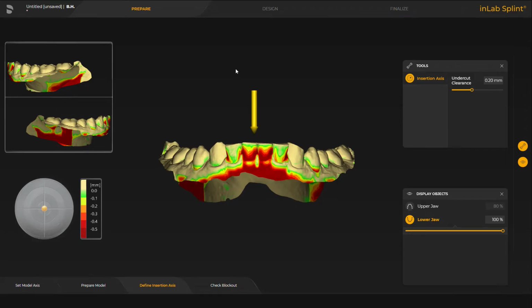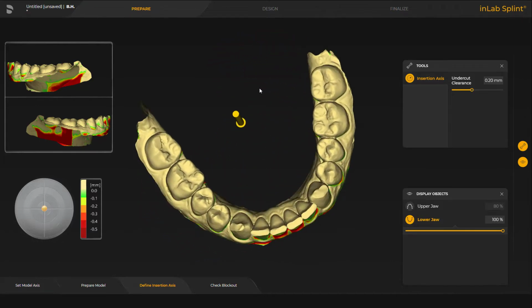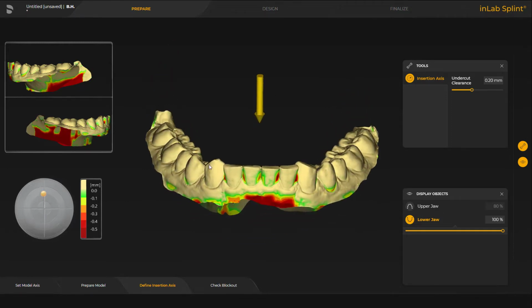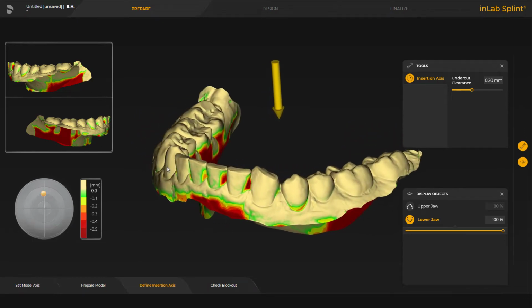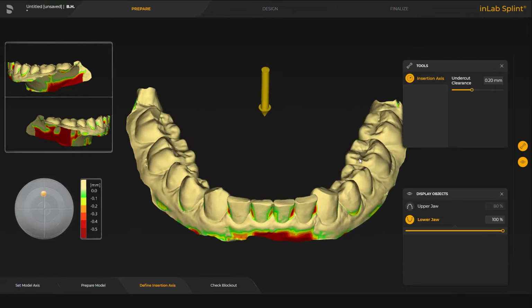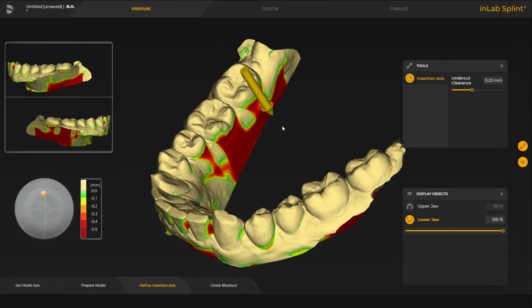The app will directly start with the insertion axis of our splint. So I'm going to try to find a nice insertion axis where I have the least undercuts in the anterior and on the buccal side. So it's comfortable to wear it.